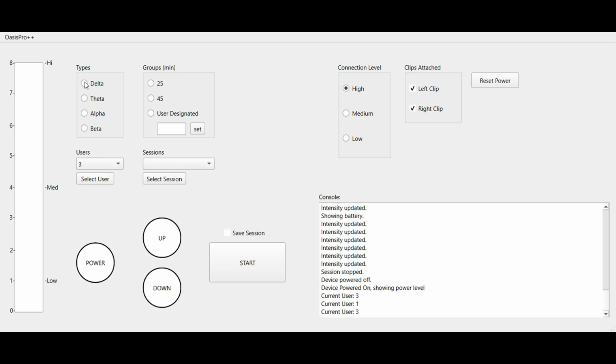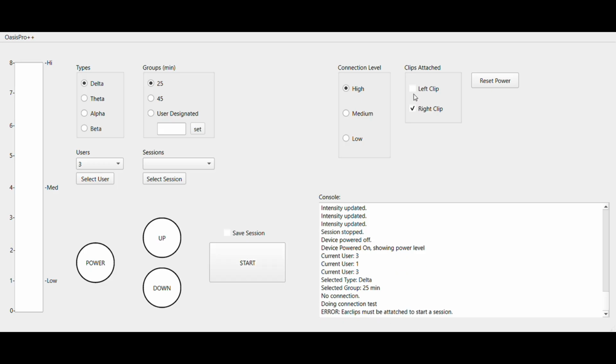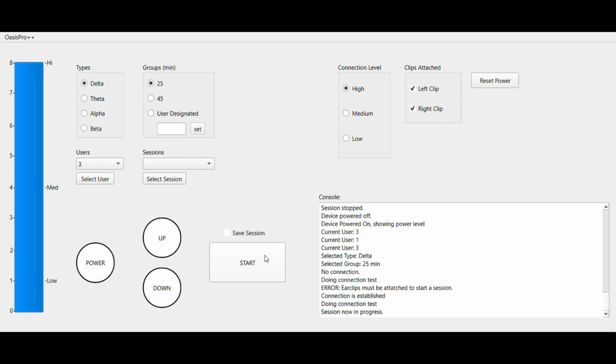So for user 3, say we wanted a delta, we wanted 25 seconds, but we didn't attach our left ear clip. You try to start the session, well, you can't because the ear clip needs to be attached. So you reattach your ear clip, now you can start your session.